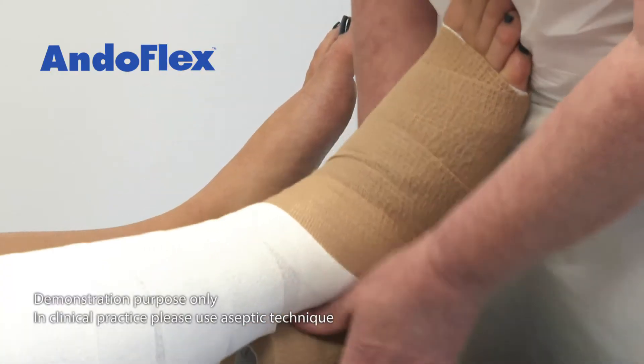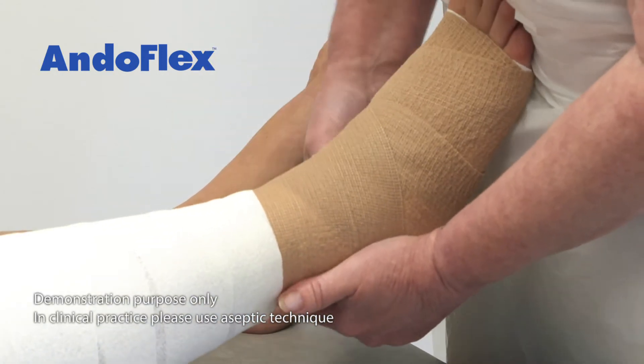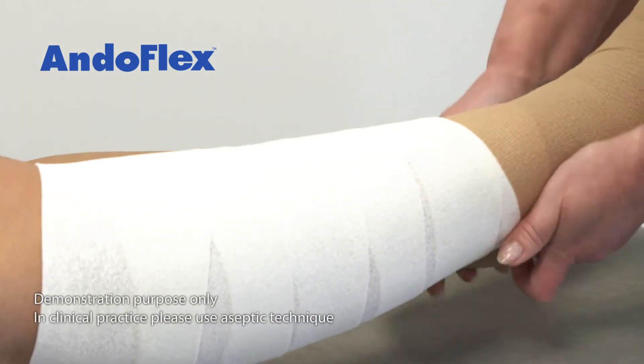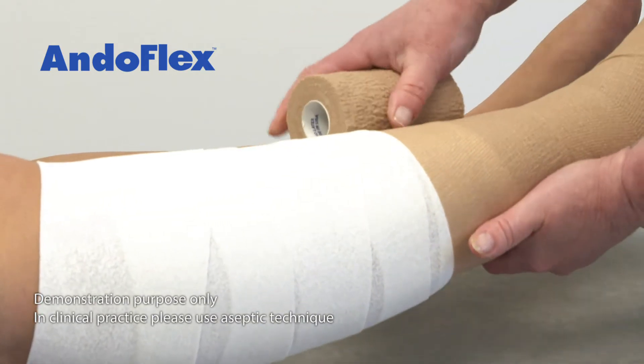Apply layer 2 at the base of the toes covering layer 1. Cover the entire heel by wrapping 2-3 figure of eights around the ankle. Continue up the leg overlapping at 50% whilst maintaining moderate tension at 75-100% stretch.